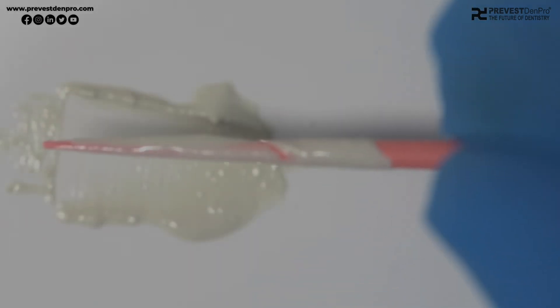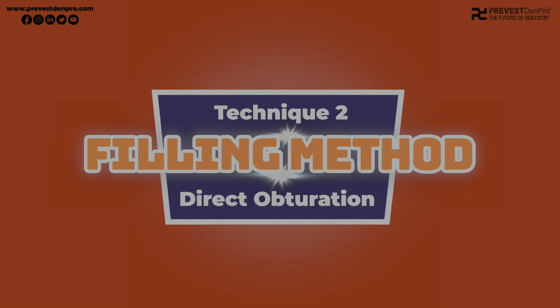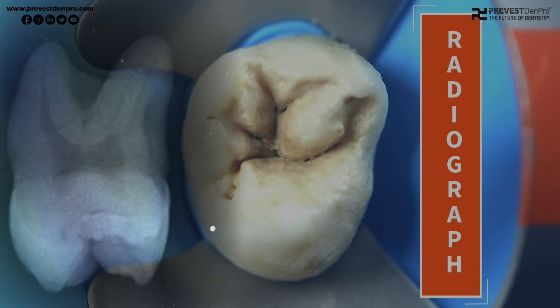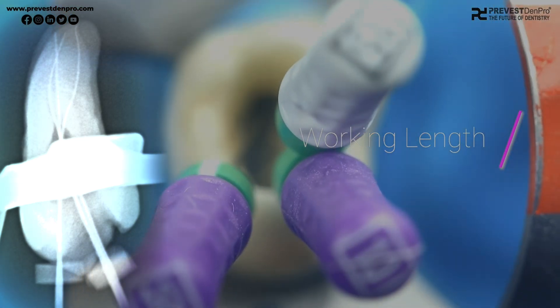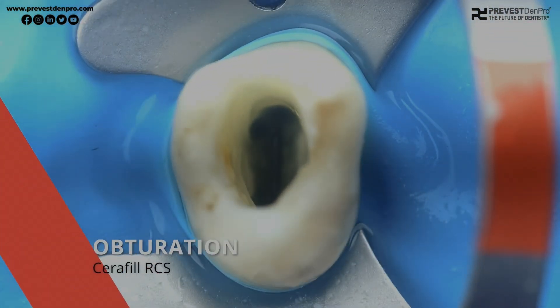The second method is the filling technique or direct obturation. We will now demonstrate the filling method with Seraphil RCS. Here is a maxillary molar and this is the pre-operative radiograph. We did the access opening, took the working length — this is the working length radiograph — and finally prepared the canals with the ProTaper Next file system.